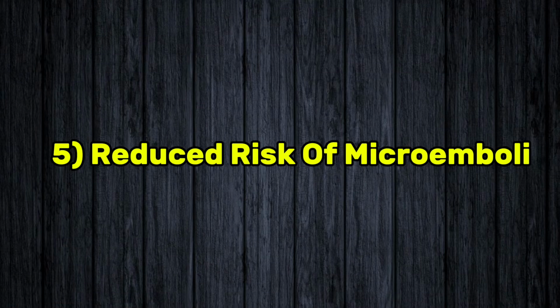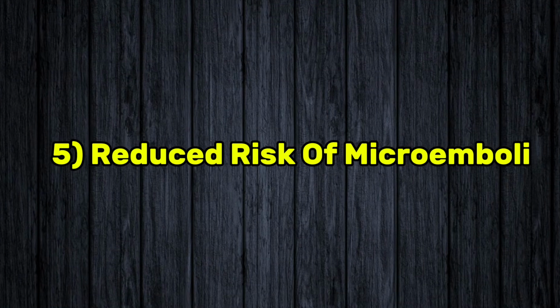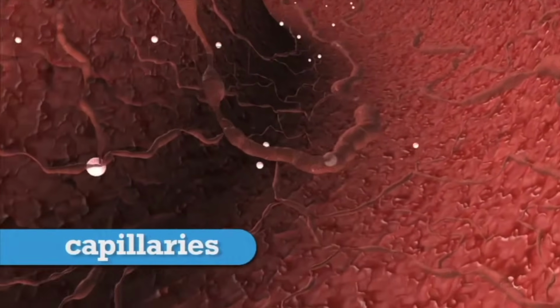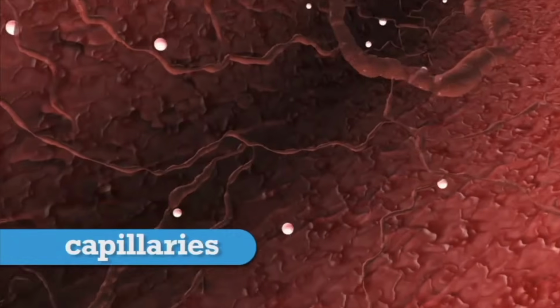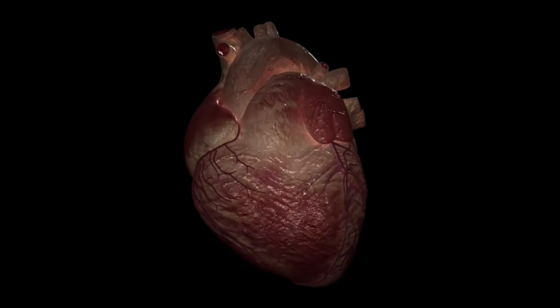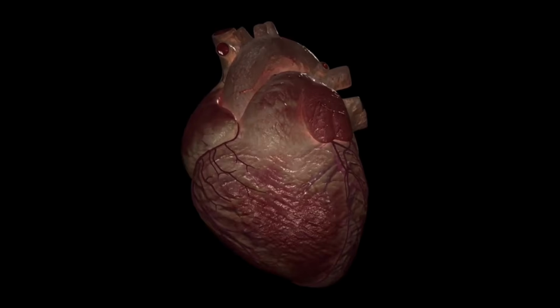Fifth is reduced risk of microemboli. Pulsatile perfusion helps to reduce the formation of microemboli by its flow dynamics, which helps to prevent the lodging of microparticles in small vessels. Overall, pulsatile perfusion makes the CPB hemodynamics more similar to the natural beating of the heart, which may reduce the stress response and inflammatory mediators.